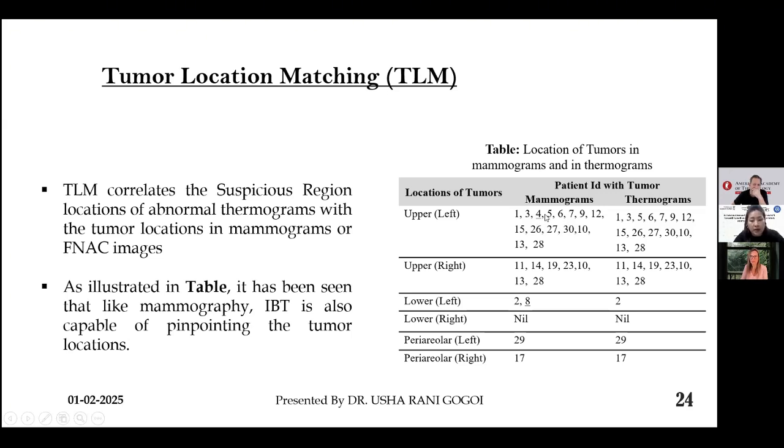Otherwise, 4 and 8. In 2 cases, the thermogram was not able to detect the tumor, but otherwise in almost all the cases, the location of the tumor in the thermogram is similar to the location of the tumor in the mammogram. That signifies that thermogram can be used as a base screening tool or non-invasive tool for those women for whom mammography is not recommended.